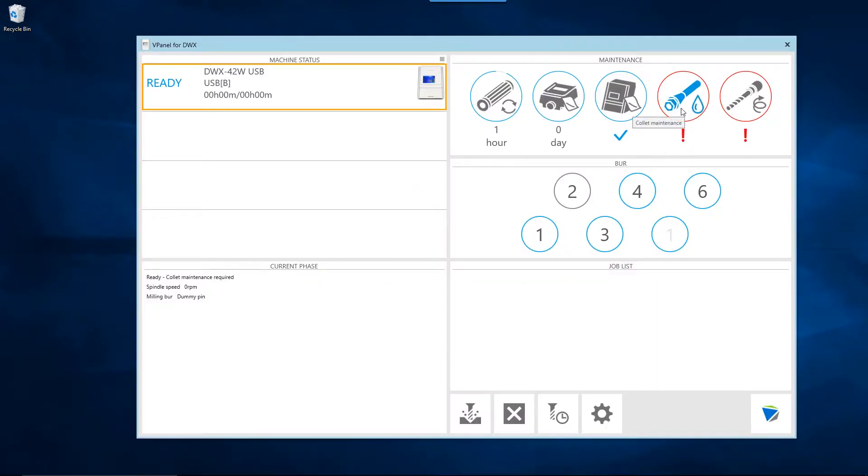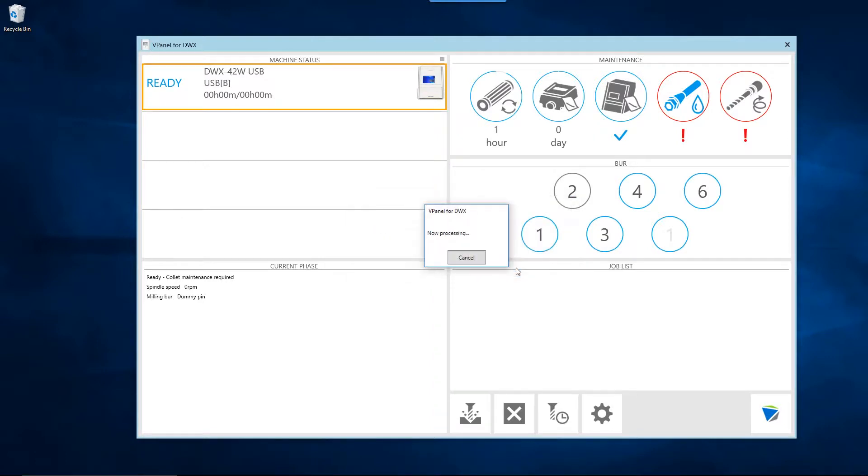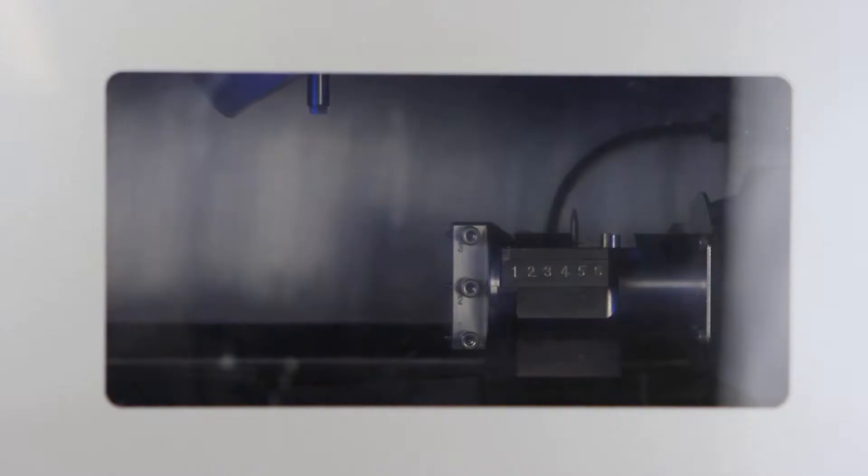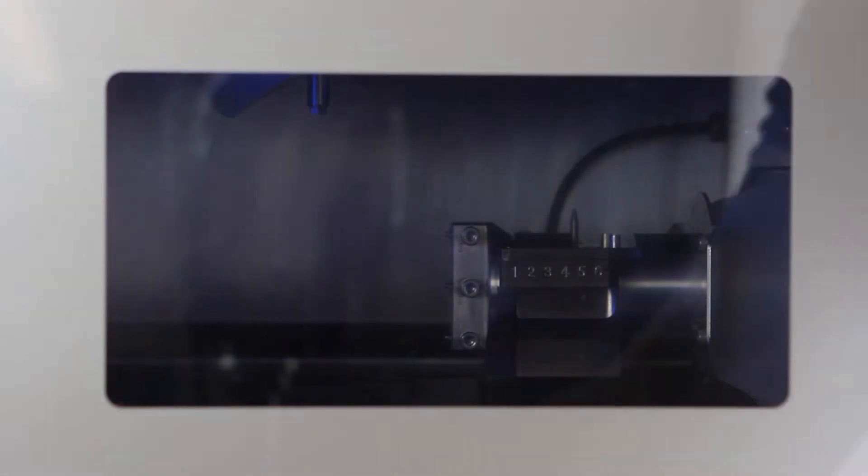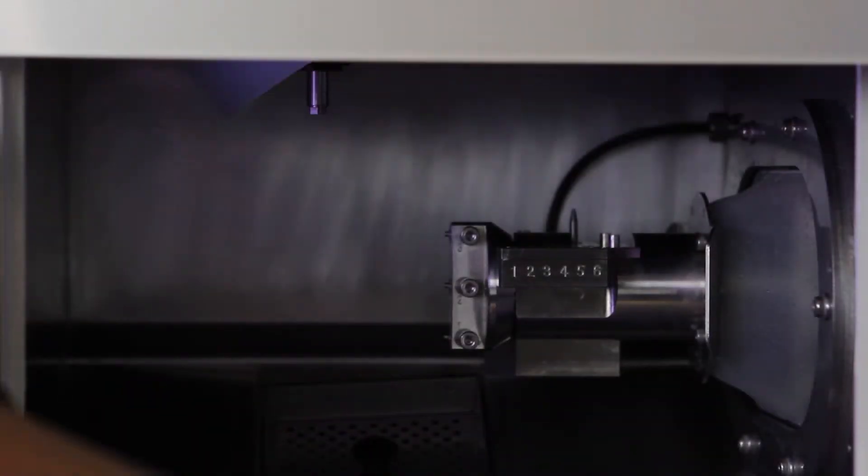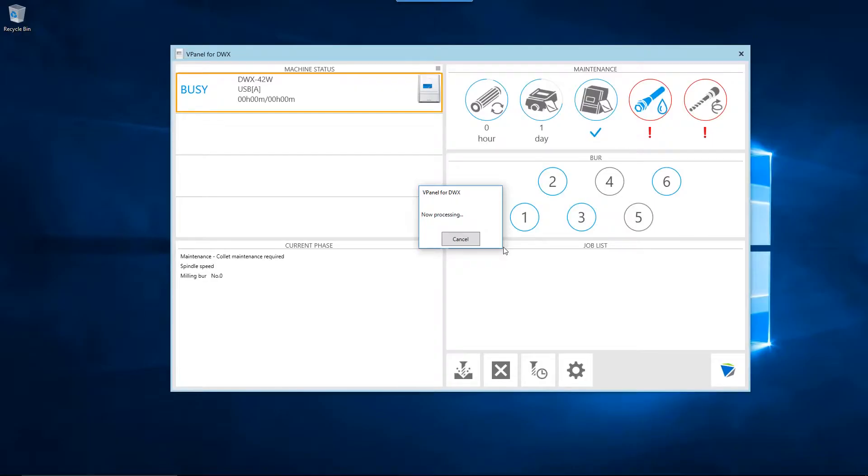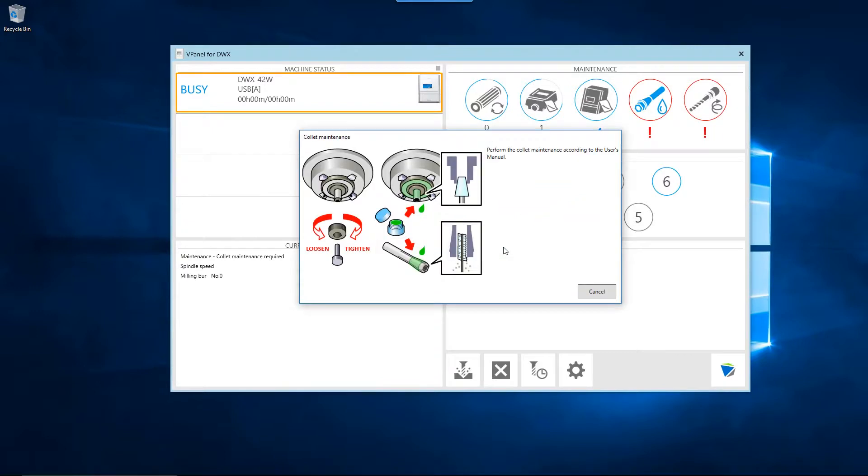Click the OK button when you have confirmed that all workpieces and correction jigs have been removed from the mounting part. The collet maintenance operation will begin. Wait until the spindle moves into position before continuing with the collet maintenance process. The vPanel will confirm when you can open the front cover and remove the collet to begin the cleaning process.